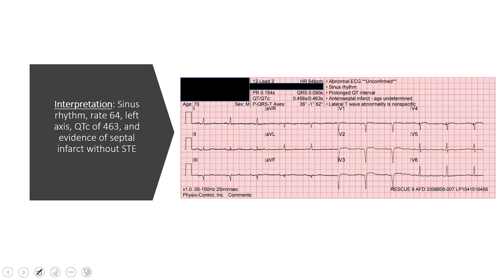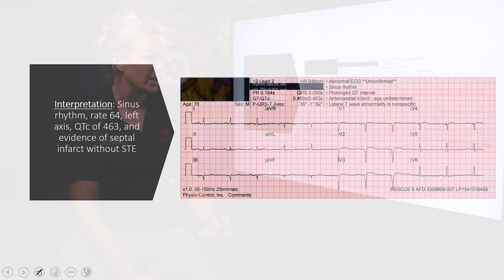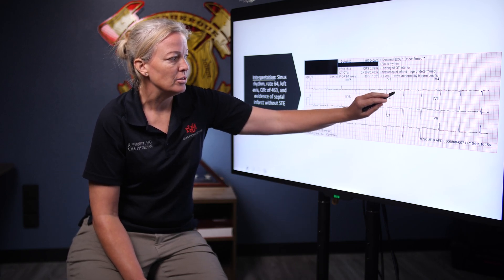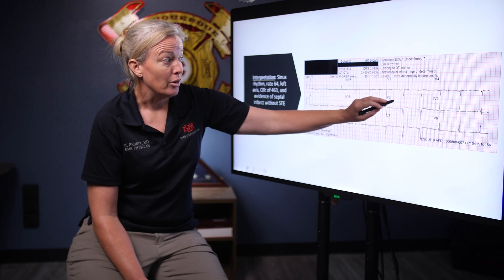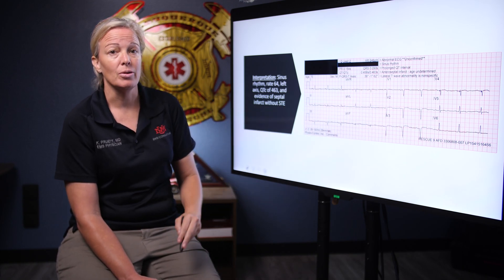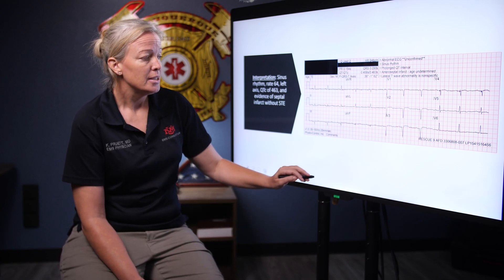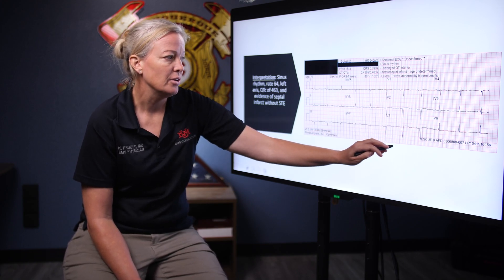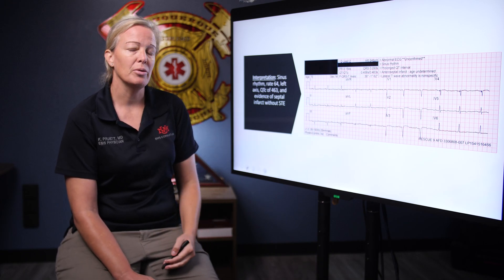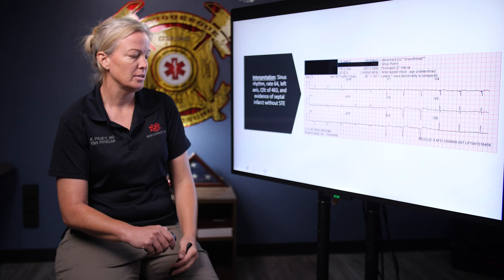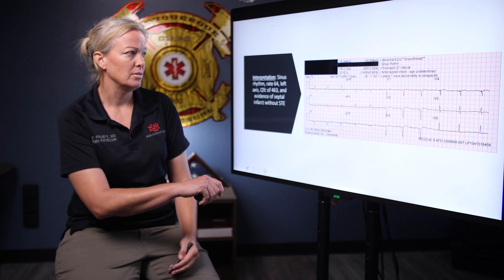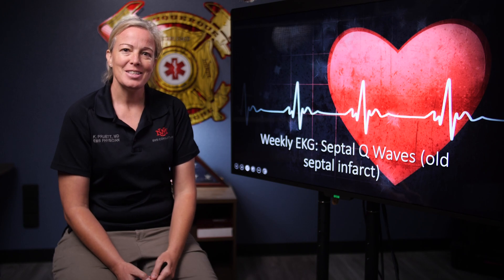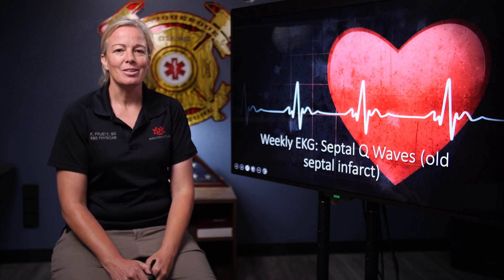Taking another look at our initial 12-lead: we've got a normal sinus rhythm at a rate of 64 with a leftward axis. We're seeing a little bit of QT prolongation and pathologic Q waves — these are greater than one box wide and greater than two boxes deep. Remember, any Q wave in V1 through V3 is not normal. This gentleman doesn't look like he's having an acute MI — no ST elevation and no reciprocal changes. I would call this probably an old septal infarct with those pathologic Q waves in the septal leads. That's it for today. I hope that was helpful. Please join us next time for our next weekly EKG.